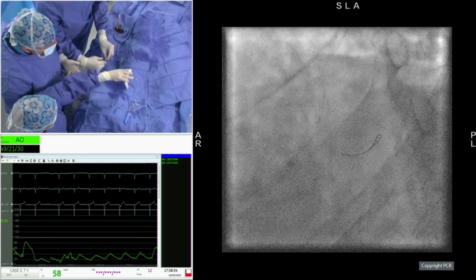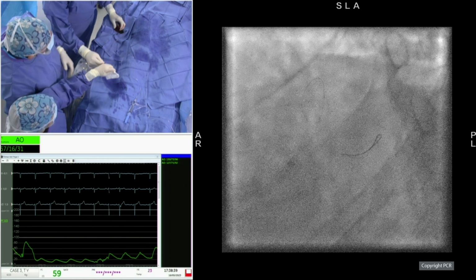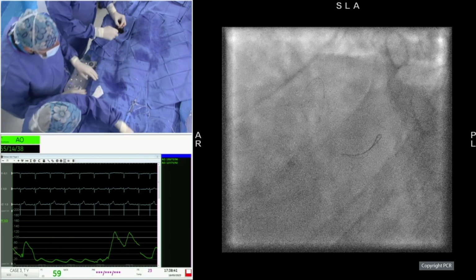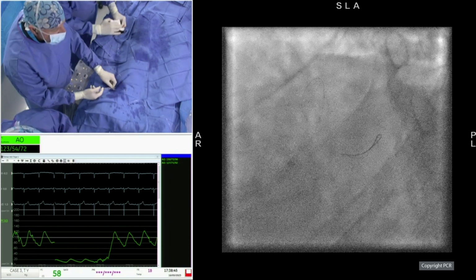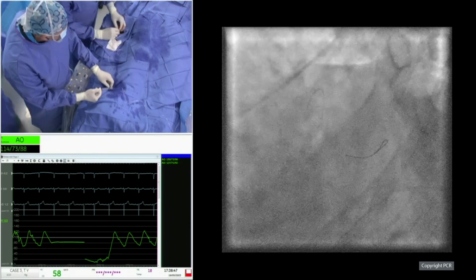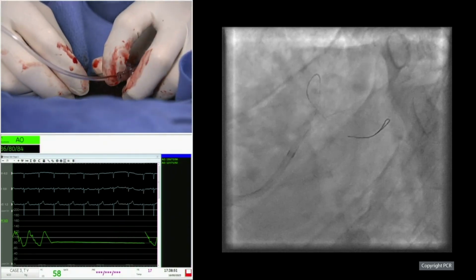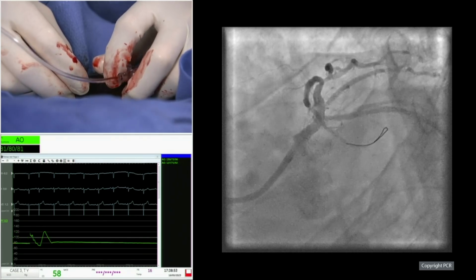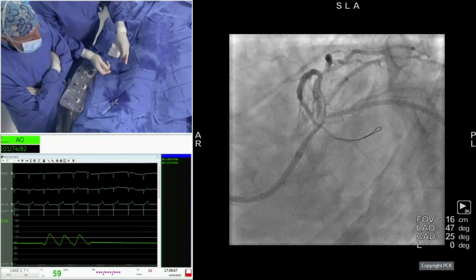And in general, rotablation is more for superficial calcification, while with the IVL, sometimes we can treat some deeper calcification. I have seen the combination of both. I've seen a very severely calcified lesion: first a small burr, 1.25, and then they were able to advance the shock wave, which is a little bit bulky.